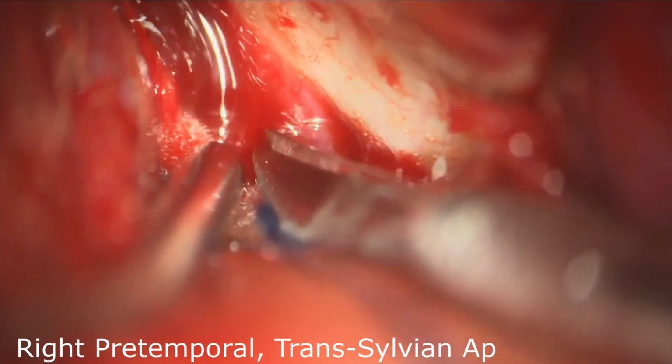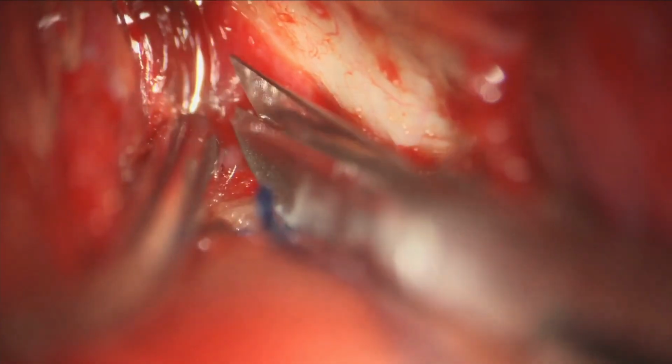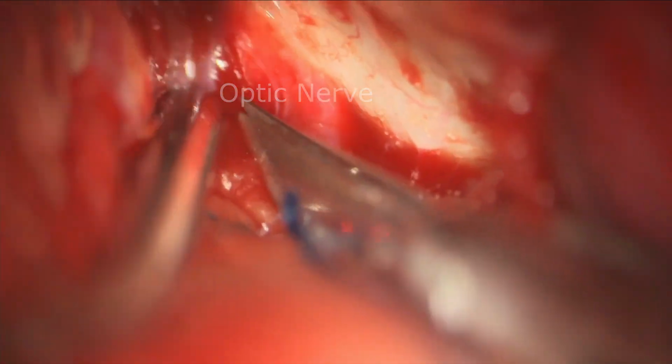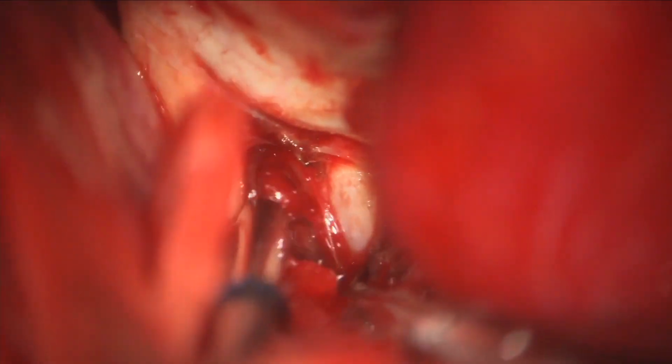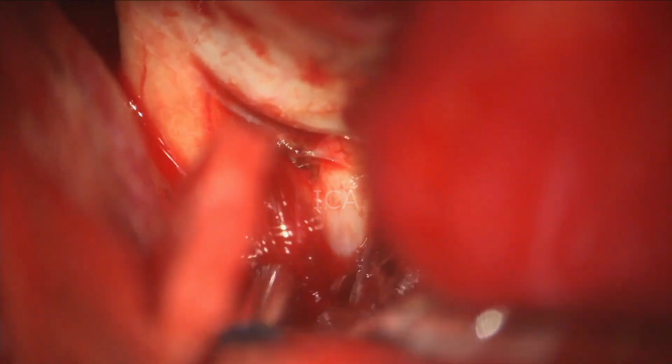We elected to perform a trans-Sylvian pretemporal approach, perform the craniotomy, and here we're dissecting the arachnoid over the optic nerve. Continue our dissection and identify the internal carotid artery.